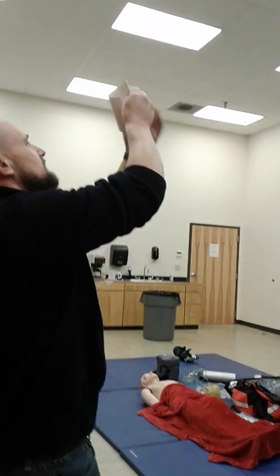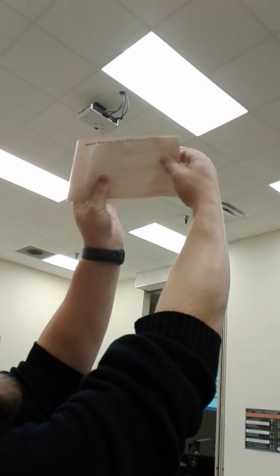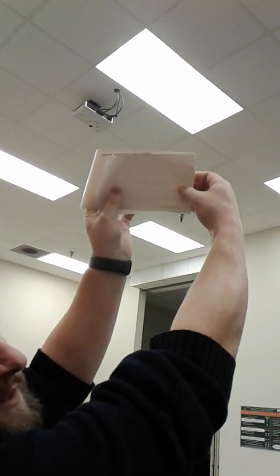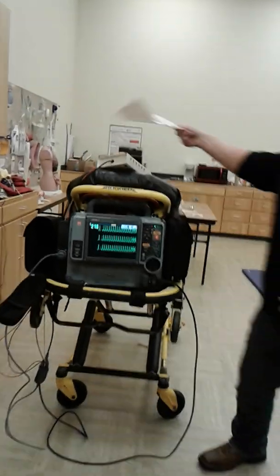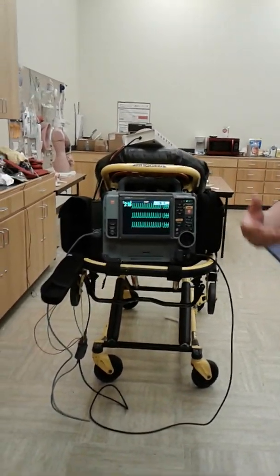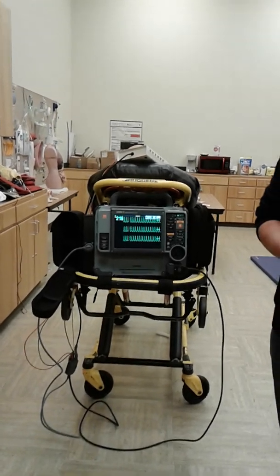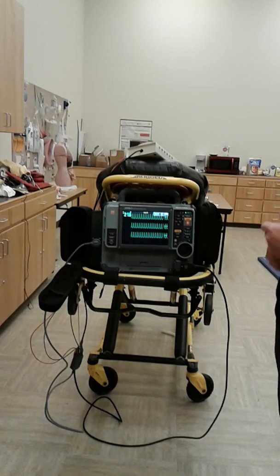Now come here, everybody. See that? They're lining up good. That's a quick method to do the same thing you're doing with your paper, laying it down and marking it out. After you look at these 1,500 times a day, you're going to be able to look at that monitor and go, okay, that's regular, all right?